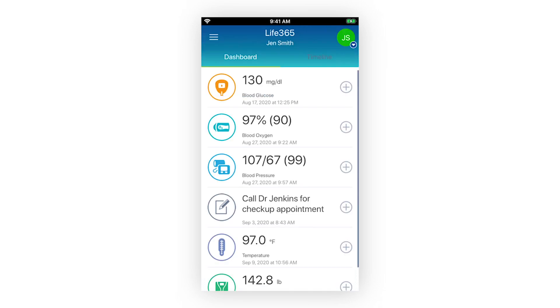If you have a medical device that doesn't have Bluetooth connectivity or is not listed within Life365's compatible devices support page, you can manually enter your measurement readings.